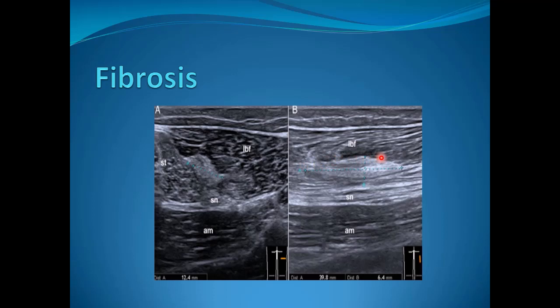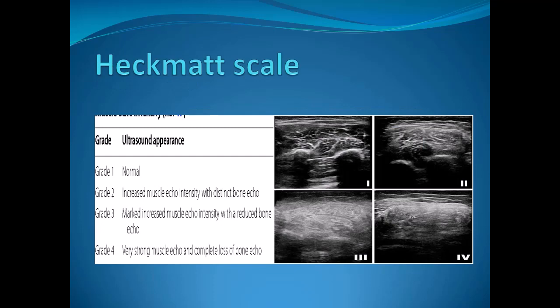Fibrosis is seen as an echogenic lesion within the muscle fibers with a history of old insult. Calcifications can also be seen, as in the previous examples noted.